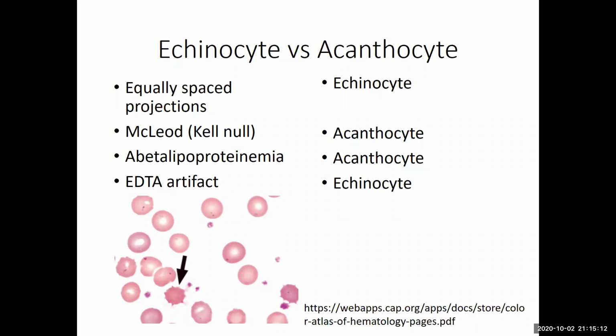And then which one was this picture? That's hard. The way I remember acanthocyte versus echinocyte is that acanthocytes have much more exaggerated projections, and I feel like you less often see central pallor. I kind of want to call this an acanthocyte.